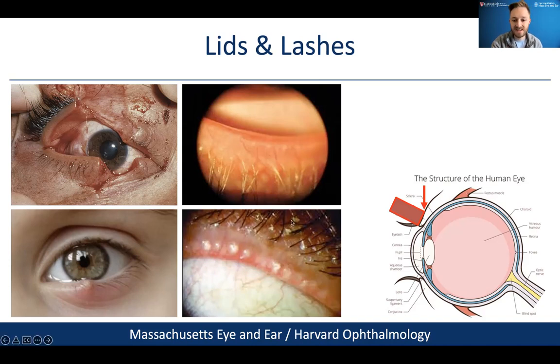You also see that on this patient's eyelid, there's a lot of yellow crusting stuff. This is called blepharitis, and it's a sign that the patient has a buildup of oily debris that's inflammatory on the eyelashes that causes irritation, redness, burning, and sometimes crusting in the morning.